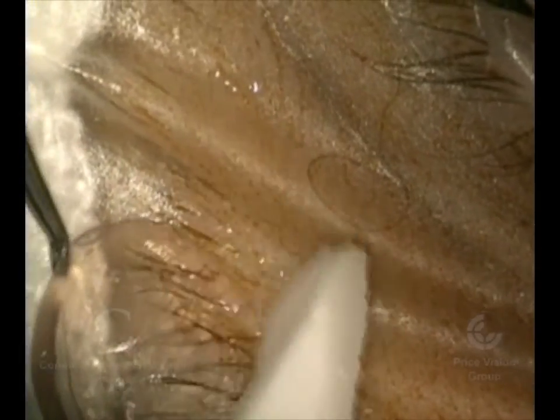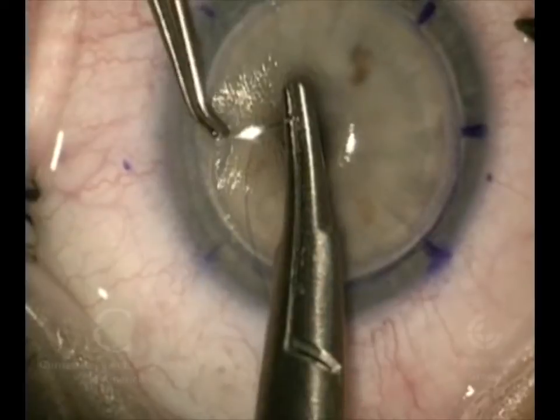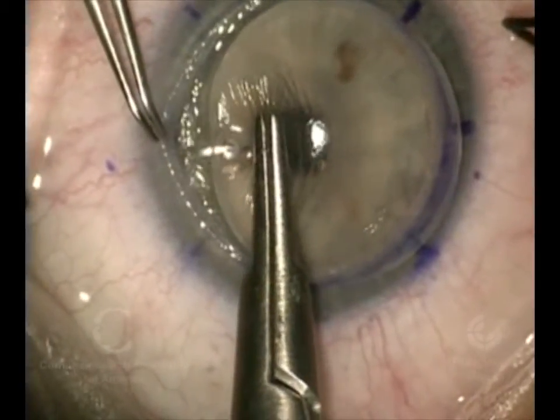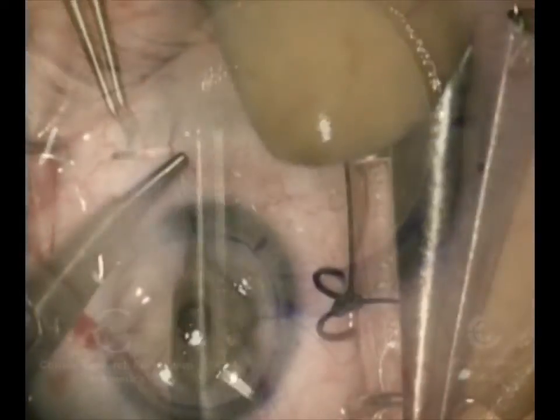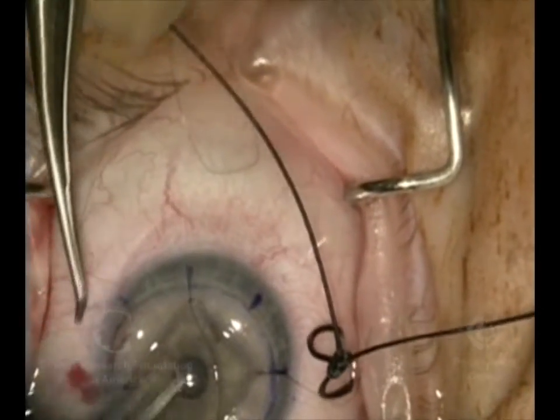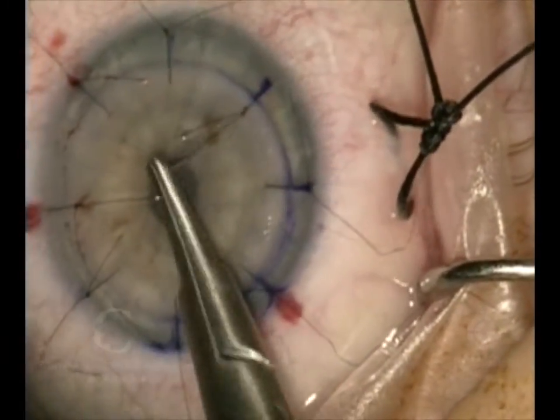Because we have the patient's own inner layer, we're going to remove the inner layer of the donor cornea. In case that inner layer breaks, as it sometimes does, we don't remove it from the donor until we're all ready to place the donor. The donor cornea goes right on top of that thin inner layer, and we're going to suture it in place with tiny delicate sutures. Once we suture the new cornea in place on top of the inner layer, the two will bind together firmly. When we examine these patients postoperatively, it's very difficult to tell the difference between this surgery and a full-thickness transplant.